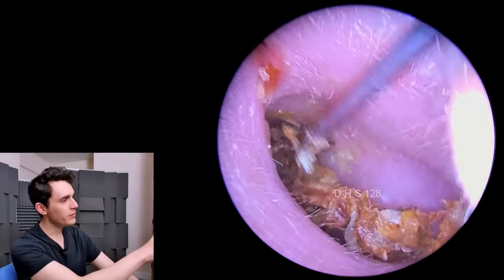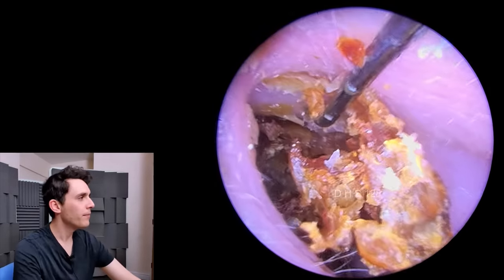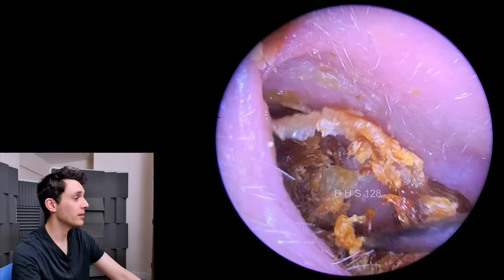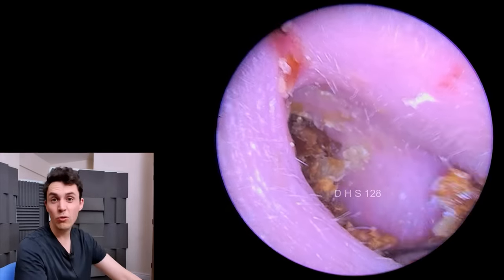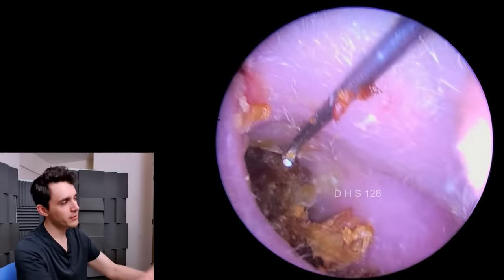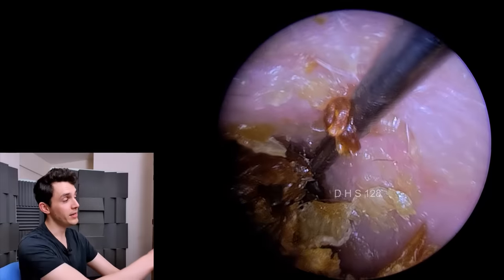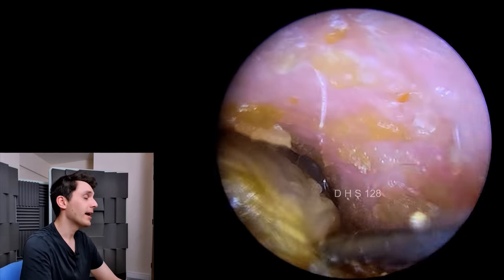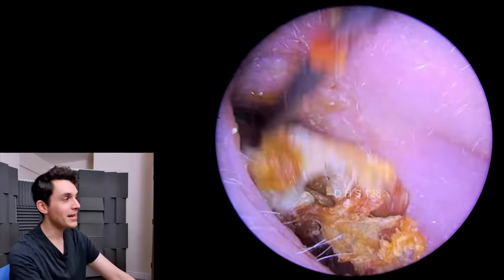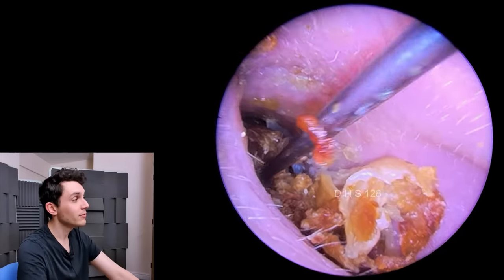What I'm starting with here is a metal hook. I've shown this maybe on a couple of videos before fleetingly. This particular tool doesn't have a name — it was made for me especially by a company called Chefmed. We'll just call it a custom hook, or hook of justice, something like that. This is very similar in dimensions to a cawthorn hook, so it's really, really small. It looks big through the endoscope but it is an extremely small thing. In my opinion, this is much better than the St. Bart's — it's smaller, it's neater, you can get into tiny tiny spaces with it, and it's very helpful in digging out blockages of this nature.